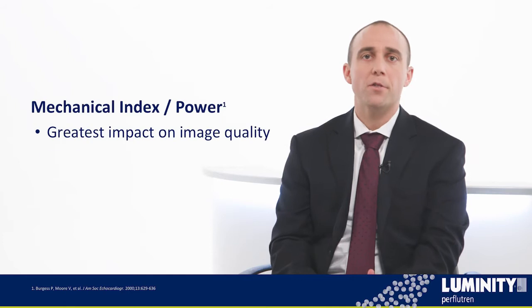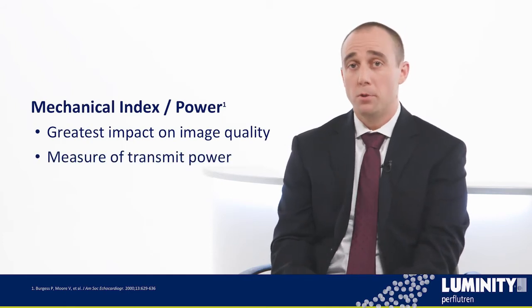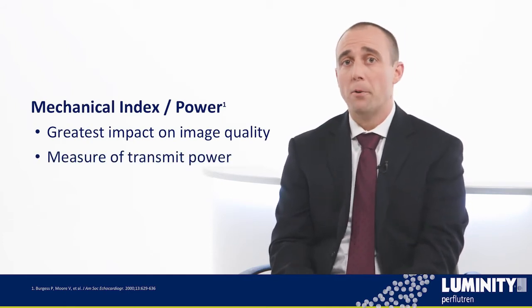Mechanical index is a measure of the power output from the transducer, or the transmit power. With Luminity, it is important to keep the system power low enough so that the microbubbles do not burst. Yet we want the power high enough in order to penetrate the sound into the patient's body and to get the microbubbles to resonate. So choosing an ideal power setting for each patient is simple, as it is determined by what we see on the ultrasound monitor.